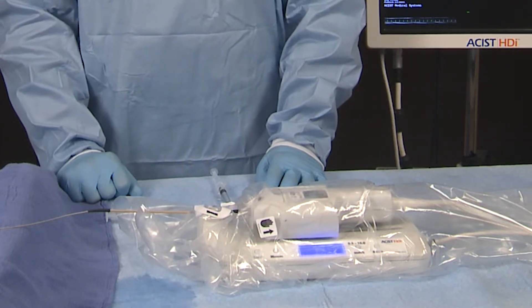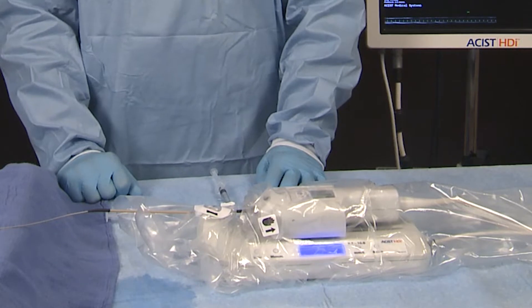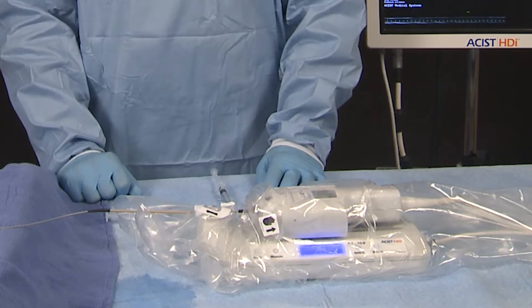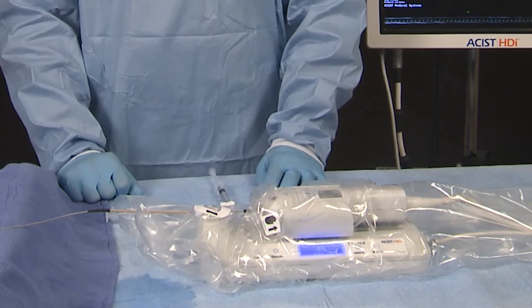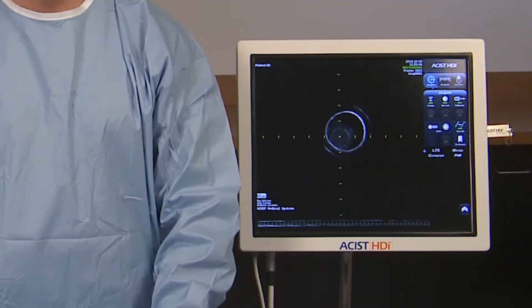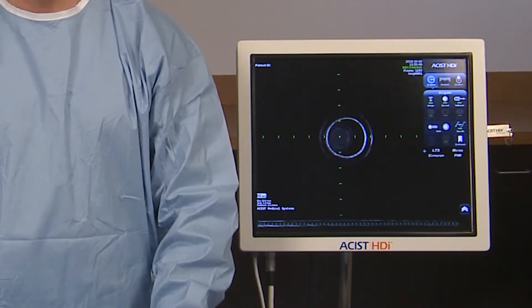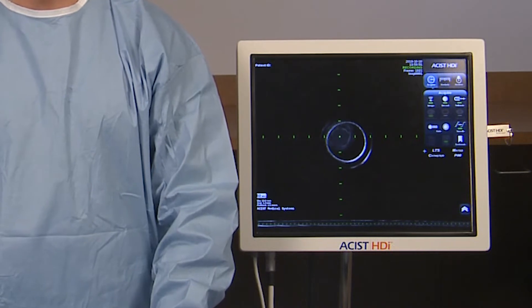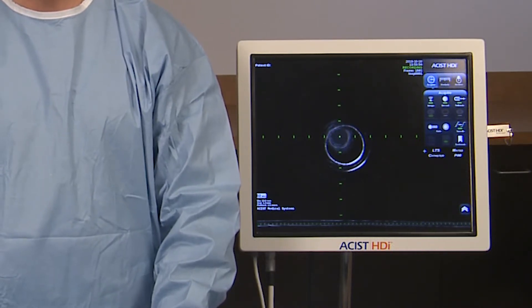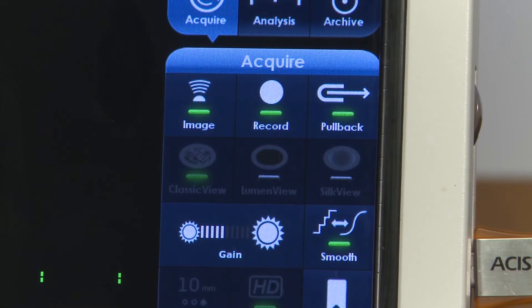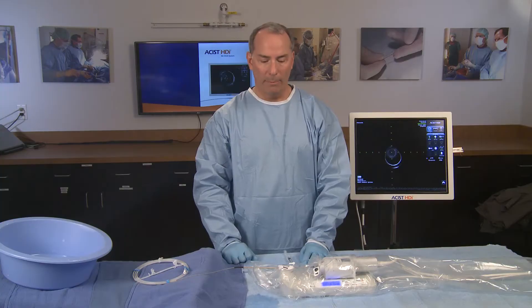When pullback starts, imaging and recording automatically starts if not previously started, and a vertical green reference line appears on the longitudinal image to indicate one millimeter intervals. To stop pullback imaging and recording simultaneously, simply press the image button on the console or the PIM.